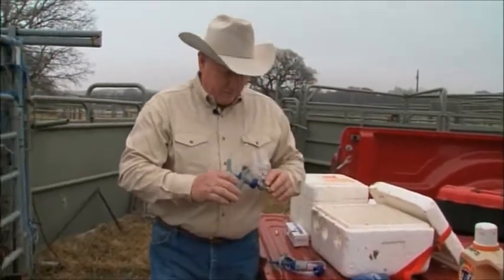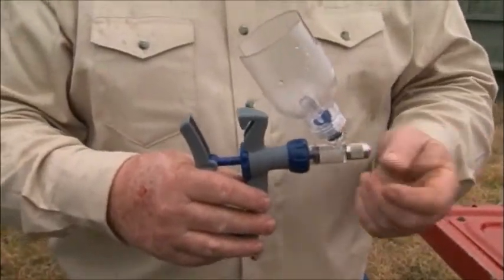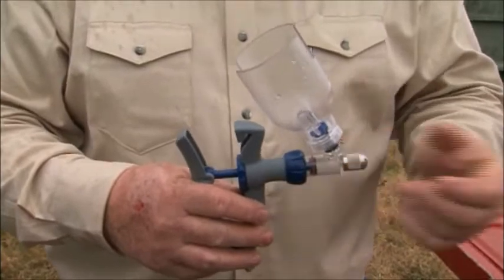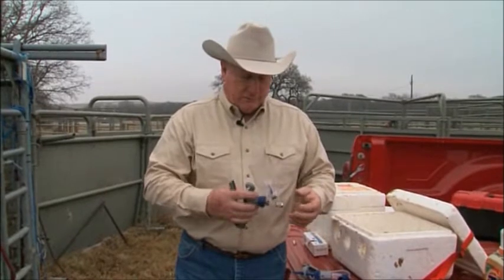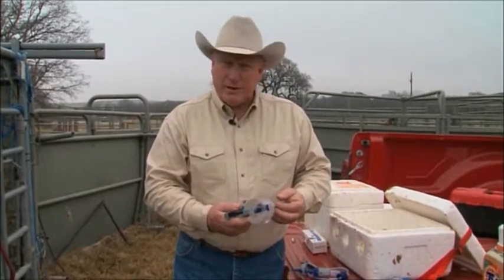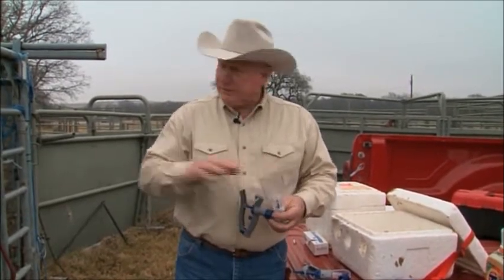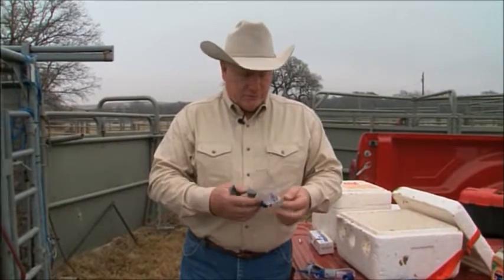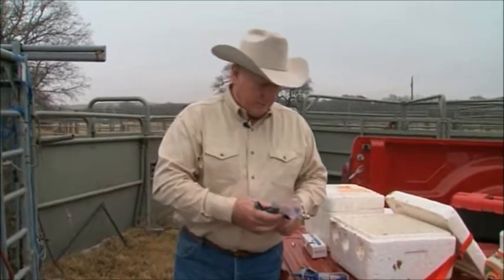We now have some syringes such as this where we actually can attach the bottle to the outside of the syringe. They're very handy, easy to use. Your vaccine is always there. One of the issues I have with these is if you set it down, sometimes you can get an air pocket, and it's very difficult to ever get the air pocket out of one of these syringes without wasting vaccine. The other thing, this can be broken as you go in and out of a chute, breaking the neck off of it, and if you don't have some spares, then you're out of business for the day. So always have backups for these.